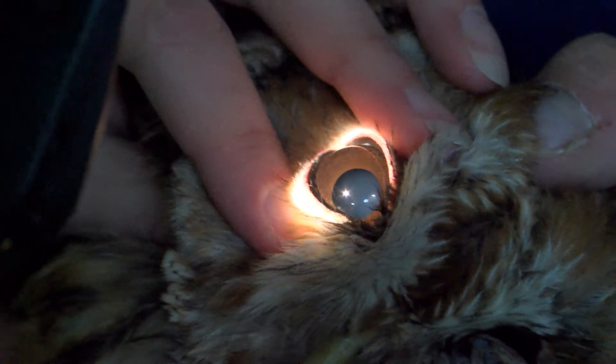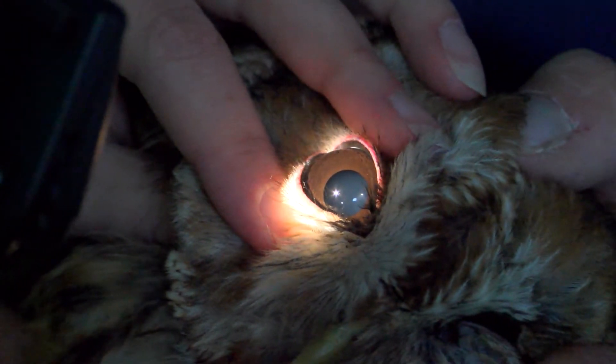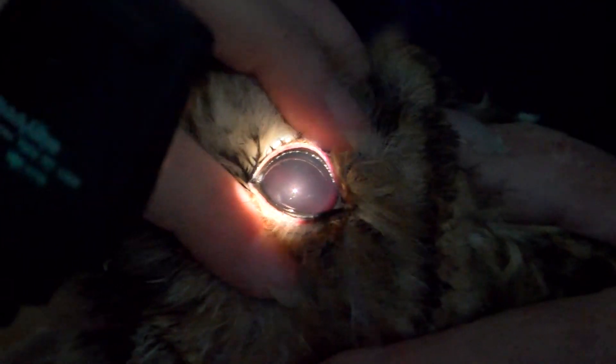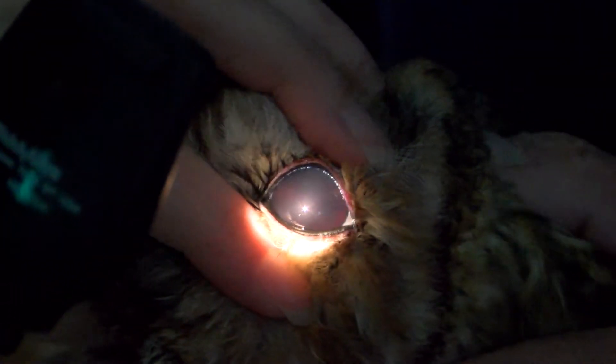If you look at the normal eye first, you'll see that I can see his iris and his pupil. You can see that. Still a lot of blood in there, isn't there? So you can't really see the iris at all? Nothing.